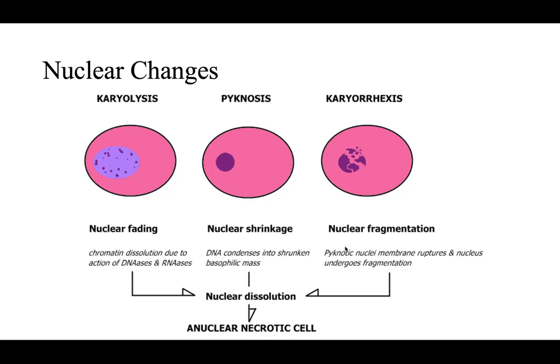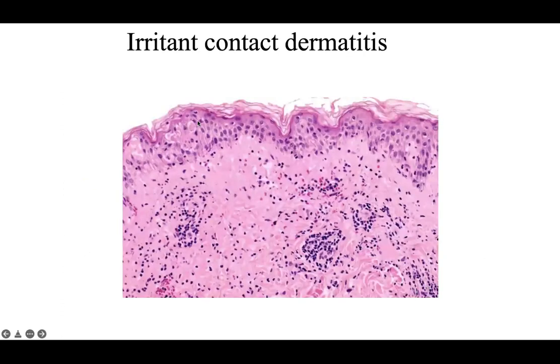But you may capture many different phases of the keratinocytes here after direct toxic, and even with apoptotic changes as well. So we'll usually say dyskeratotic or apoptotic, but usually with apoptotic cells, you'll find just really hot pink cytoplasm, and then these nuclear changes here. You can see this hot pink cytoplasm coming in. It almost looks like the same color of the dermis here. It can be even more hot pink or bright pink than this.